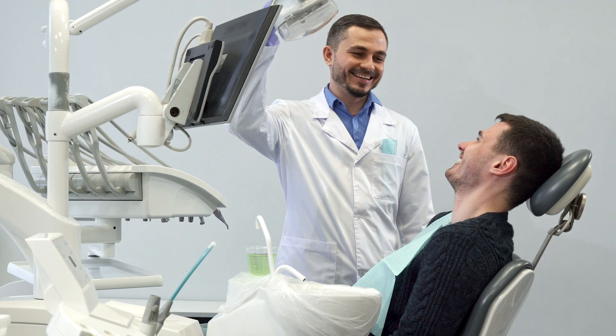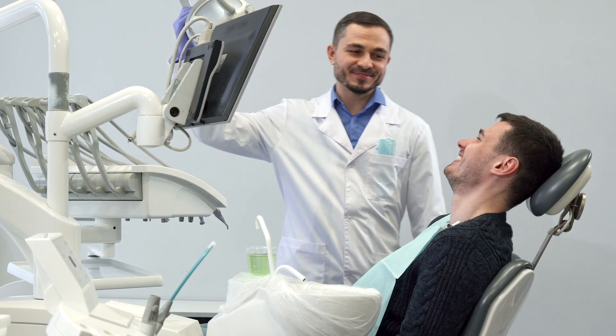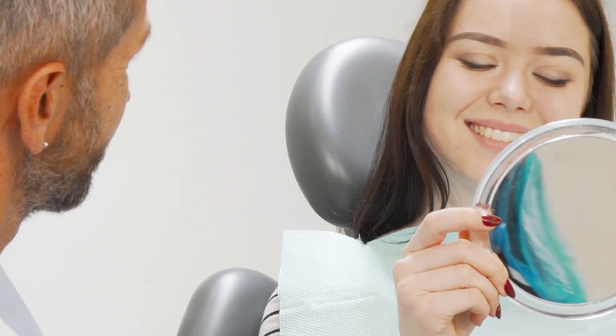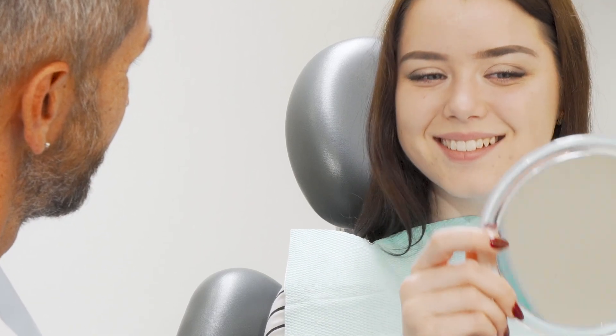Say goodbye to partial dentures that require multiple adjustments and extra chair time. Say hello to speed, accuracy, and satisfied patients.